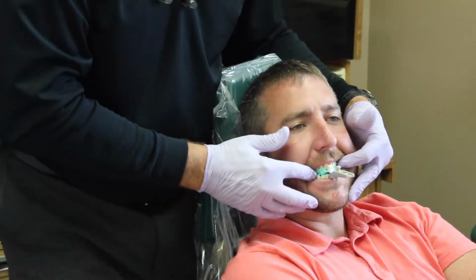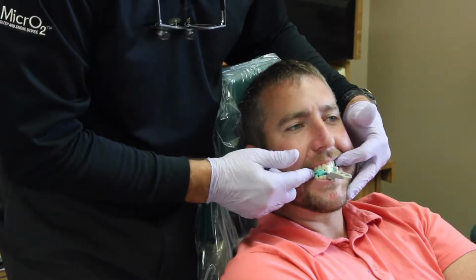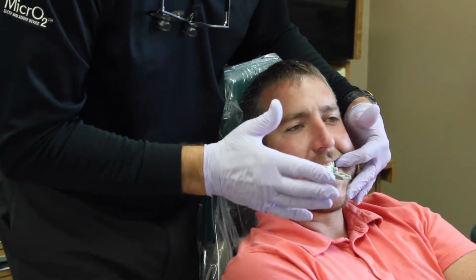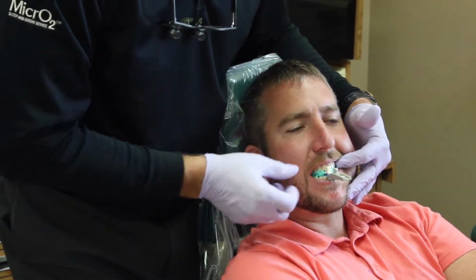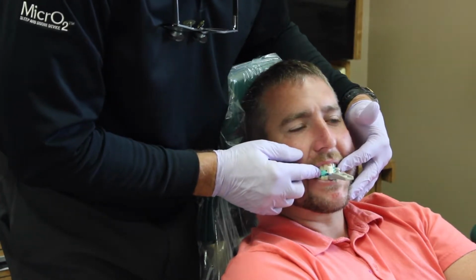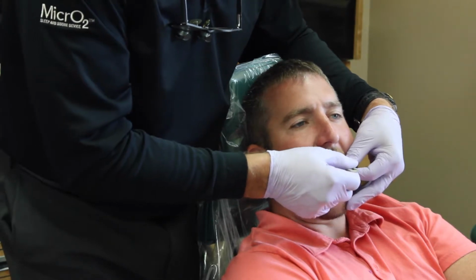And what we're doing now is we're capturing an upper and lower bite impression on the bite fork at the position that we determined to be about 6.6 millimeters into an 11 millimeter range of motion. 60% of the range of motion. The material sets very quickly, so there's no real time for the patient to wait. Go ahead and open, Jeff.